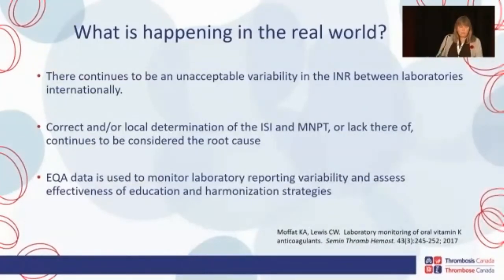External quality assurance data is used to monitor laboratory performance over time, and it is a way for EQA programs to monitor the effectiveness of the education and the harmonization strategies that are happening around the world. So the INR is not the magic bullet. There is still a lot of variability around the world. However, it is much more reliable than thinking of the PT in seconds between laboratories.